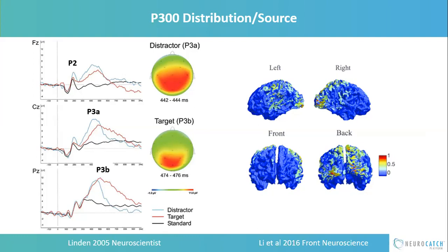Sorry, they flipped this. That's another thing I should tell you. This happens sometimes: NeuroCatch flips it for users, but by convention in ERPs, historically they plotted negative as up and positive as down. You can blame electrical engineers, because it was those guys that did it. But what's happening more and more is that people intuitively think positive should be up, so waveforms are being flipped. I was talking too fast and missed the fact that in this one, they've flipped the waveform so you're seeing the P3 up.